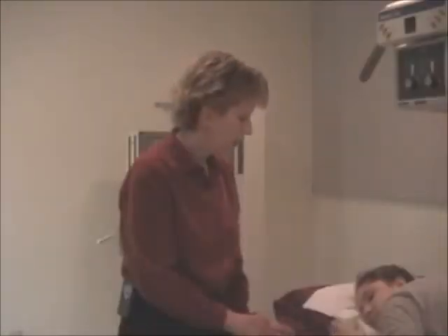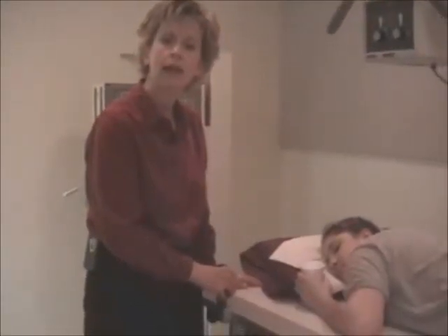Let's go to the table. We'll see you in a minute. I've got our patient Kristen set up for an RAO of the esophagus. Again, I'm going to start from the mouth and work my way down through the system. And remember, you may be taking this in different orders. The doctor's protocol will actually dictate what precise positions or projections you will be doing.